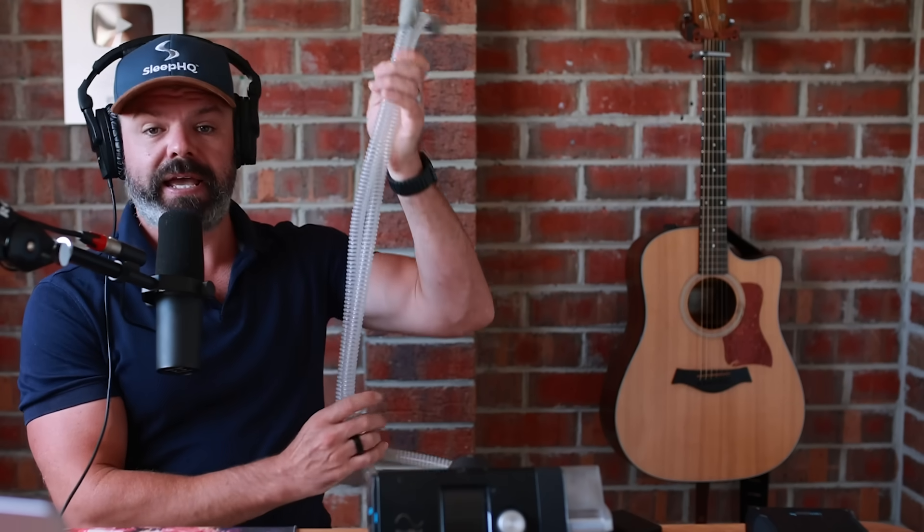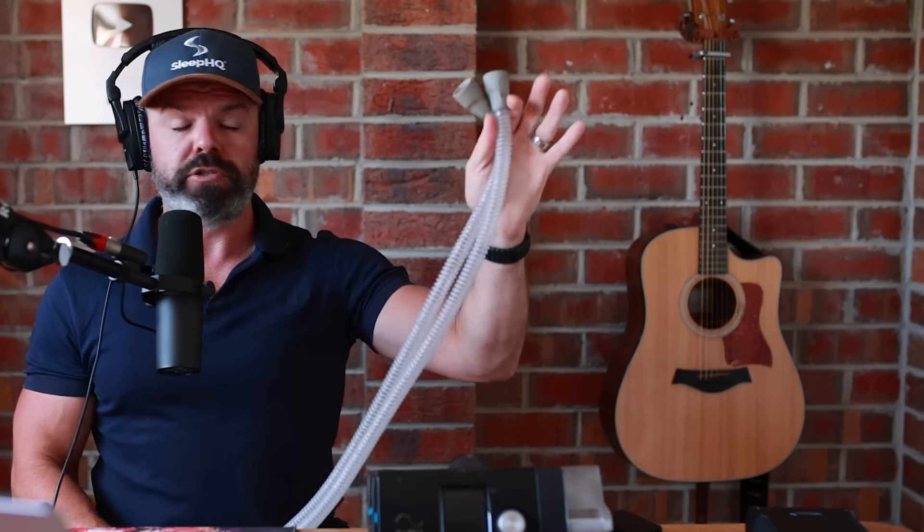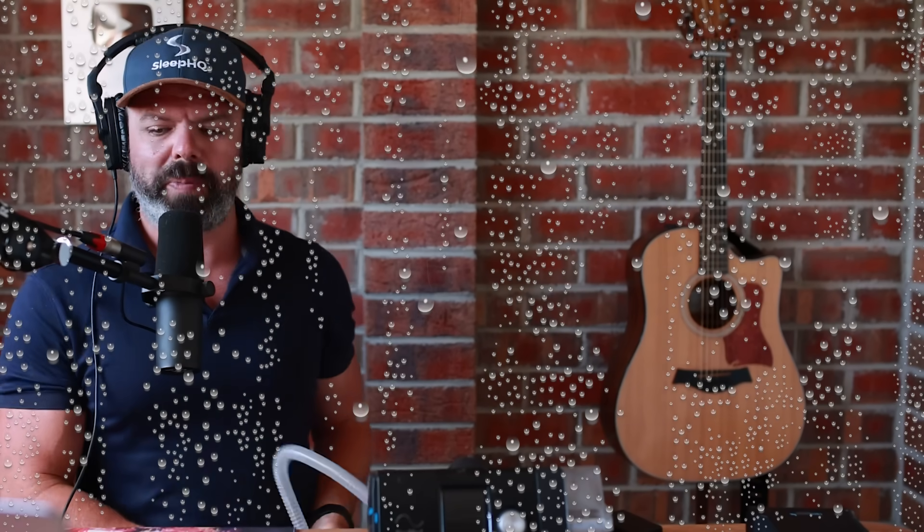Now we can run this AirSense 10 with a standard tube — a non-heated tube. And I see a lot of people using a non-heated tube. By the end of this video, I can pretty much guarantee you'll all be shopping for a heated tube. Much better — you get more humidification and it also enables you to optimize the humidification to reduce rain out. We'll talk about that more in a minute.